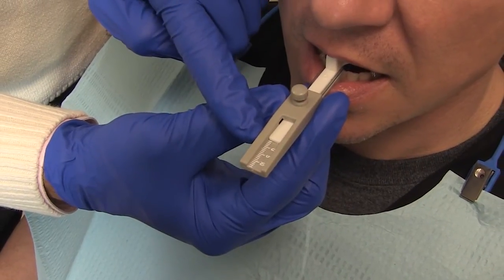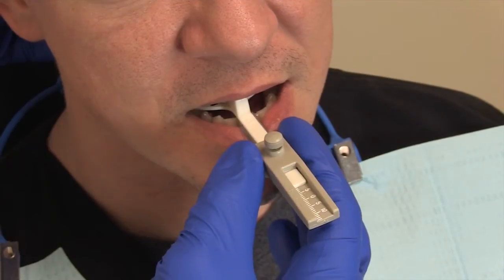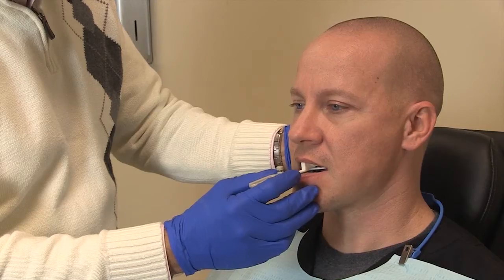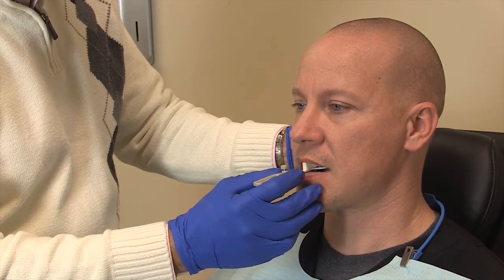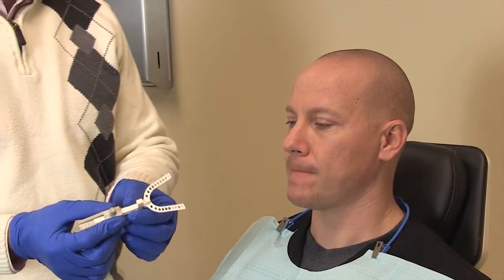Have the patient go into their normal centric position. Next, have the patient slide their mandible as far forward as possible. This will dictate your maximum protrusive range. Repeat 3 or 4 times. Instruct your patient to be very comfortable and very fluid in the movements. Record the centric position and the maximum position as demonstrated here in this video.